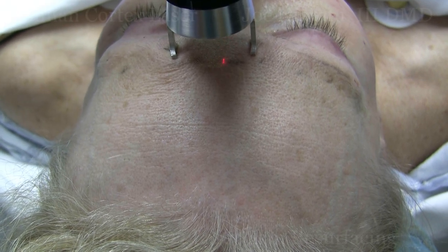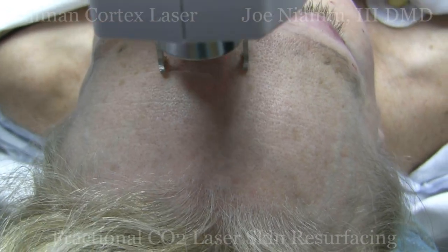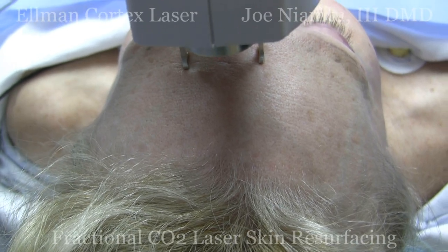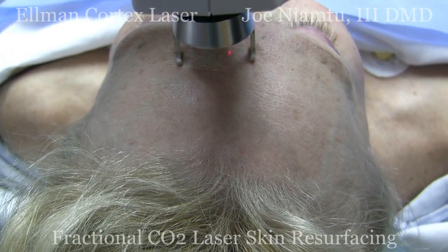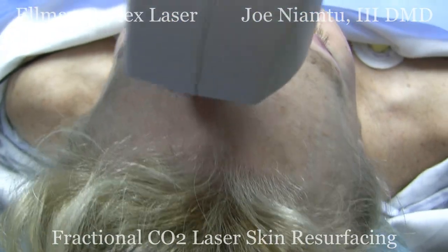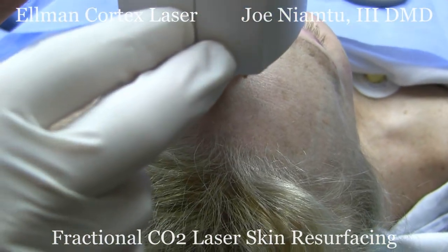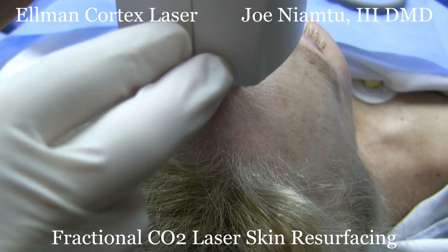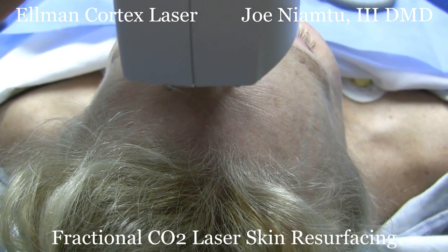One of the nice things about an 18 millimeter spot size is it covers a lot of area. You want to make sure that the little waveguide posts are flat against the skin — you don't want them tipped, you want them to be perfectly flat — and you want to line up your squares so that there's no overlap and no underlap.